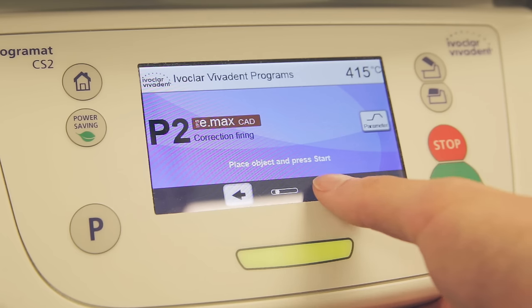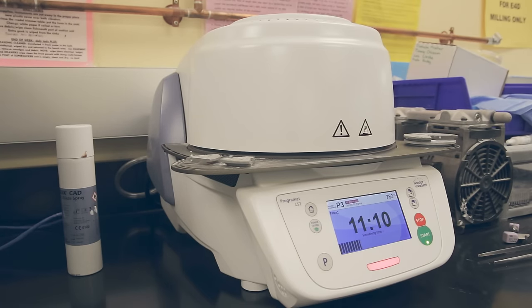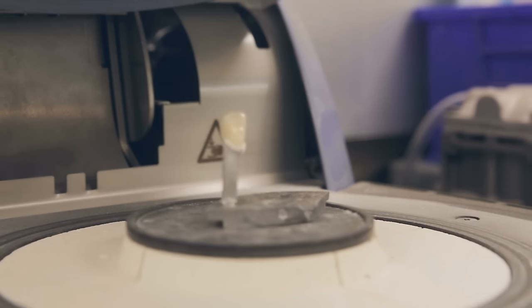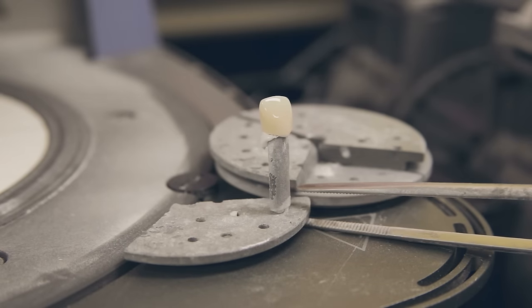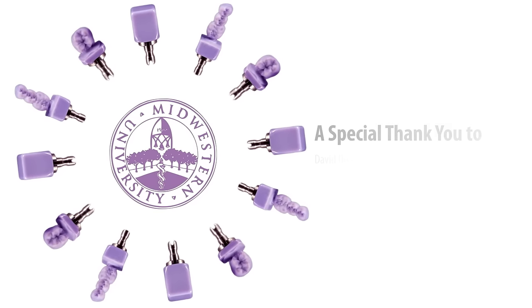For this video, we will use the P3 program for firing our crown. The P3 program takes about 15 minutes and is the fastest option for firing an Emax CAD-CAM crown. The purple Emax crown is now a nice shade of A2. The crown should be allowed to cool prior to seating. Once cooled, the crown can be seated following the same protocols for a lab Emax crown.